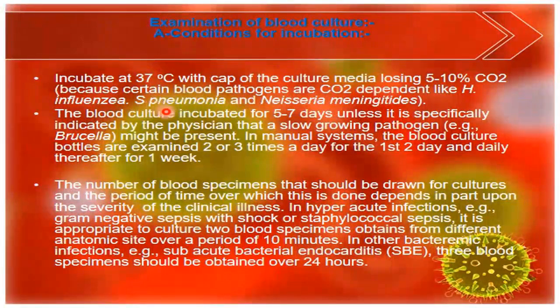The blood culture is incubated for 5 to 7 days unless specifically indicated by the physician, like Brucella. Brucella needs maybe up to 1 month. Okay. In the manual system, the blood culture bottles are examined 2 to 3 times for the first and second day, daily thereafter for a week.